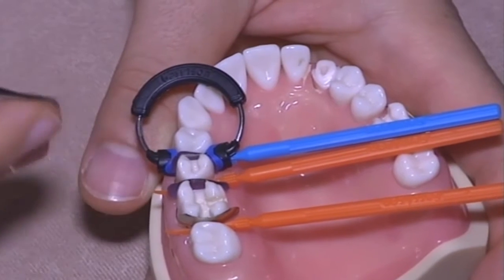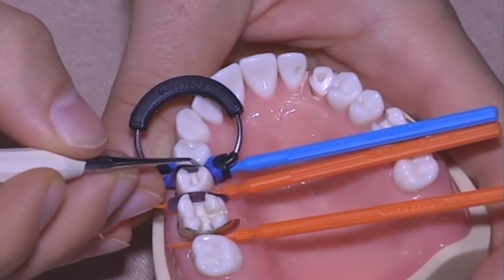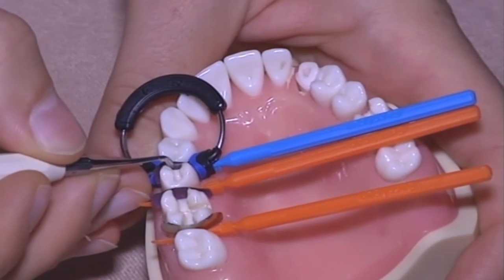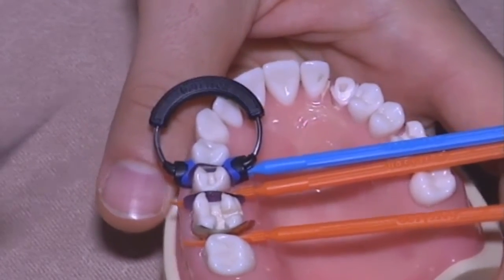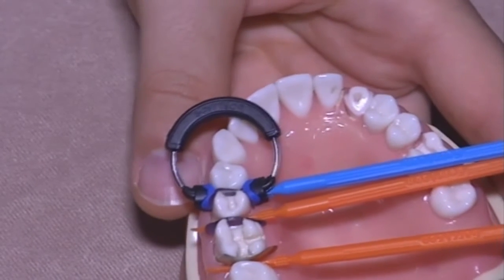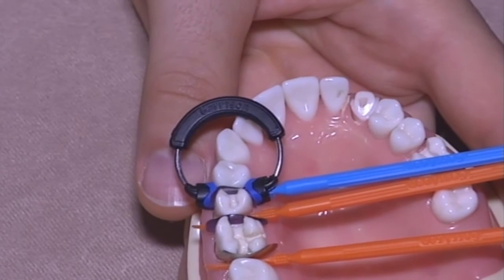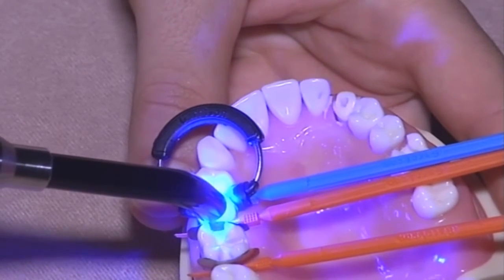And any matrix can simulate that perfectly. You have to do that with a thin spatula. And if you regulate the right amount of composite, you will obtain a very, very, very thin interproximal wall. Light curing.